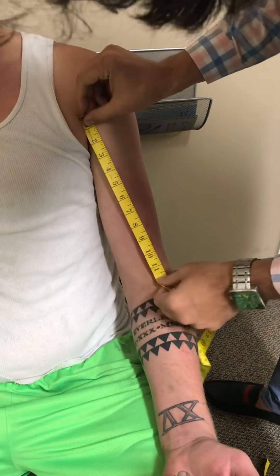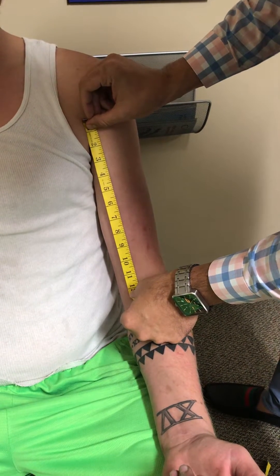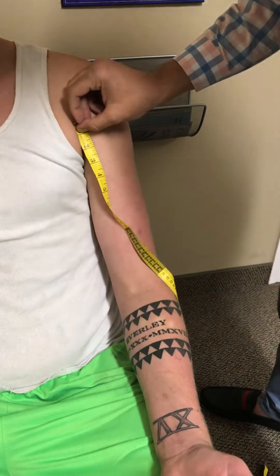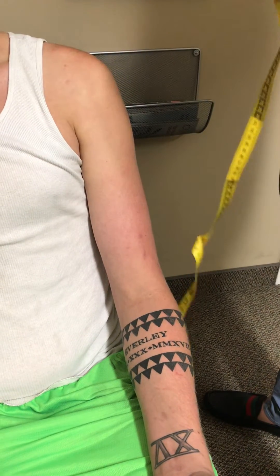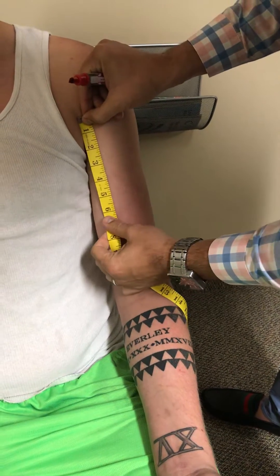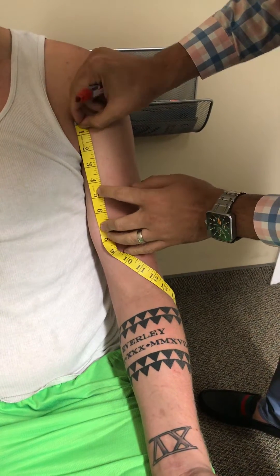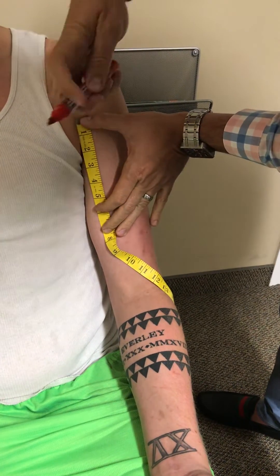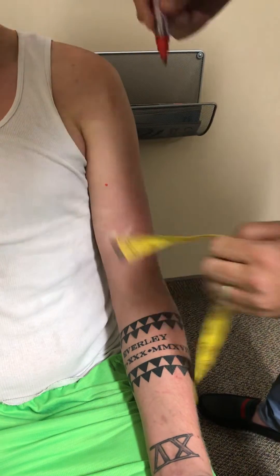The anterior axillary fold to the cubital fossa is about 12 inches. Next, I'm going to measure the distance which in my manual I list as the motor point for the biceps brachii — 4 inches from the top of the anterior axillary fold — and we'll mark it.